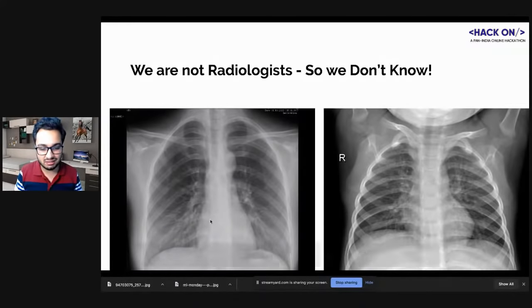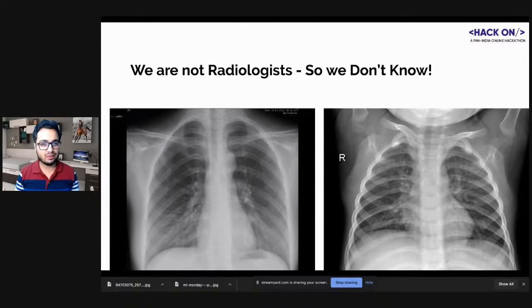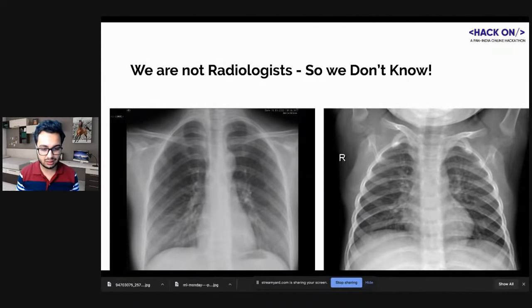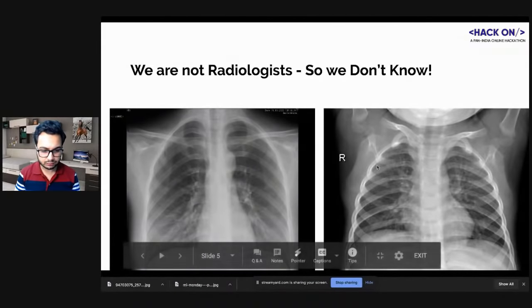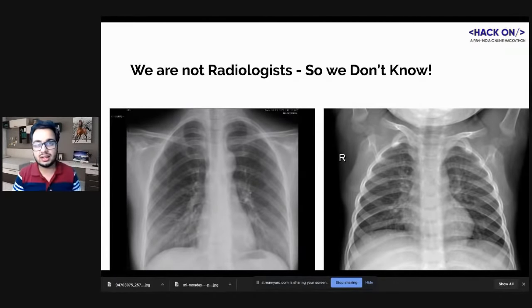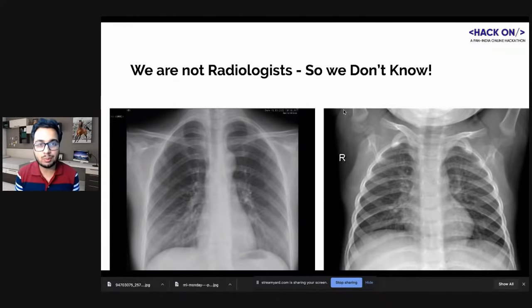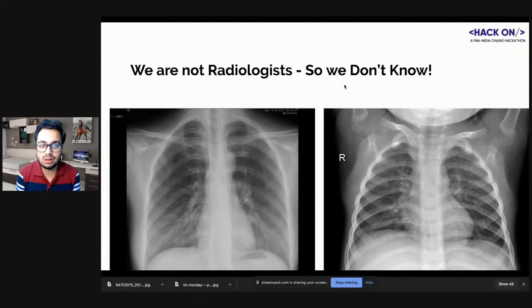These are X-rays from two different patients — don't compare rib structure. You need to see patterns inside the lungs: blurriness, different textures. The image shown is small, but real X-rays are pretty large so you can see minute details. The features here are fine-grained features, making this harder than dogs-versus-cats since the two images are visually very similar. It's a fine-grained visual recognition problem.